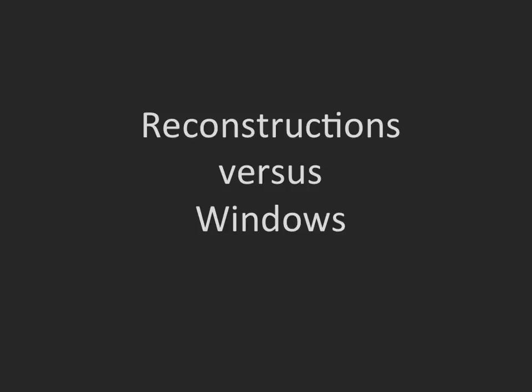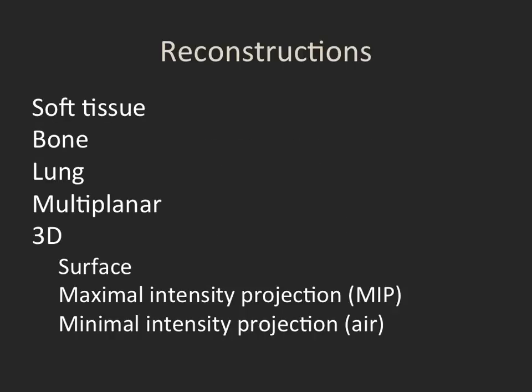So first of all, there's a couple of things I want to clarify here: the difference between a CT reconstruction versus the different windows that we display the information on. First of all, to talk briefly about reconstructions. Reconstructions are usually done by the technologist, but some of these can be done by the radiologist on a different workstation sometimes, or sometimes within the PACS station.